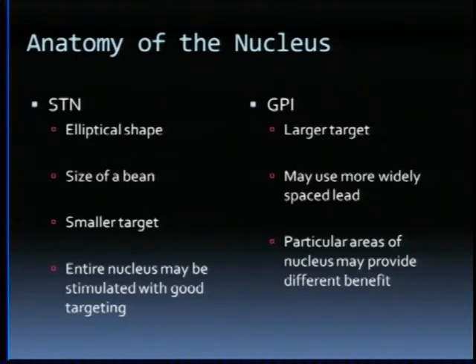The good news about that, number one, is you need a skilled surgeon to be able to hit it because it is smaller, which we fortunately have two of here in town. However, with the lead that we use to implant, we can often stimulate a large portion, if not all, of the nucleus, which could be very beneficial. So that's one of its positives.